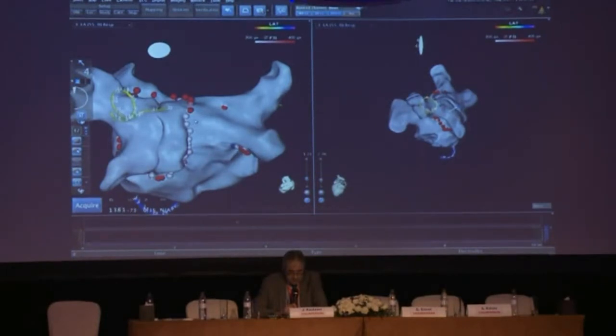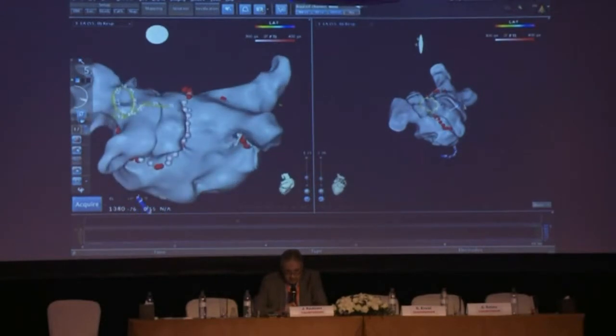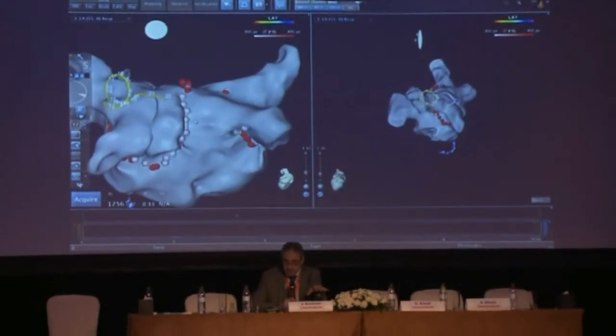We've been using the VisiTag software upgrade on CARTO, which means that I've put a manual scale so that the 300 gram seconds is in the white and cream area, and over 400 is red. And so you can see that on the back. Richard, maybe you can explain a little bit what does it mean. I don't know if everybody is familiar with VisiTag software for CARTO.